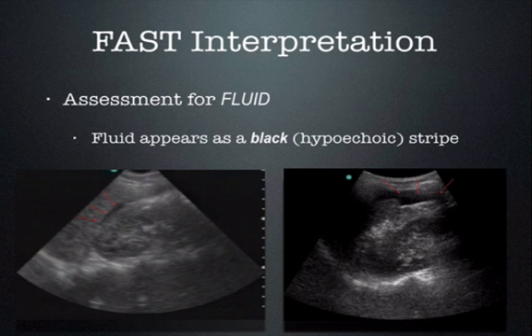So what is our goal in this exam? Our goal is to evaluate for free intra-abdominal fluid. All fluid looks black. We assume that it's blood in the trauma patient because that makes sense clinically, but all fluid is black.